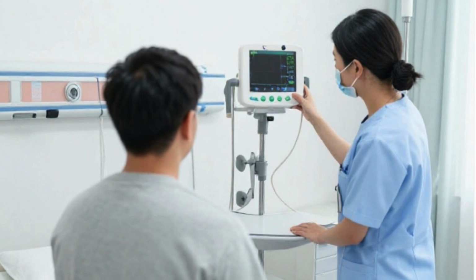Maintenance and calibration are essential to ensure accurate patient monitoring. Preventive maintenance includes checking sensors, cables, displays, alarms, and batteries. Calibration ensures that measured values, such as blood pressure and oxygen saturation, remain accurate. Failure to maintain and calibrate patient monitors can result in incorrect clinical decisions.